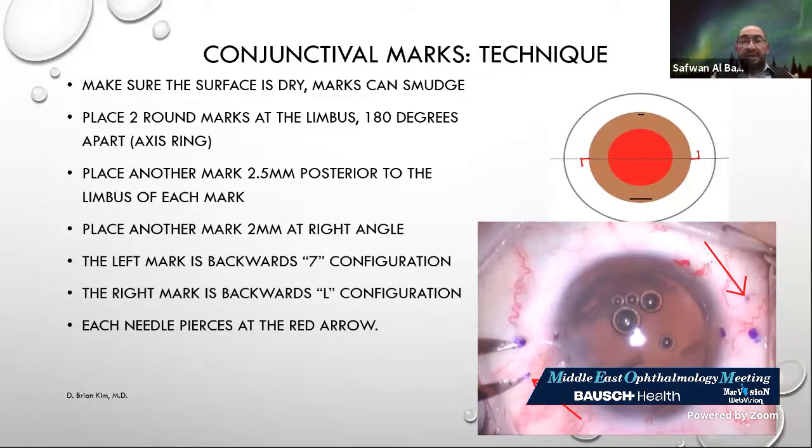They don't know that the second paracentesis is your modification. Yes, so the 6 o'clock position, or the contra-incisional paracentesis, is where I'm going to externalize the leading haptic, and that's my modification, and I'll talk about that shortly.